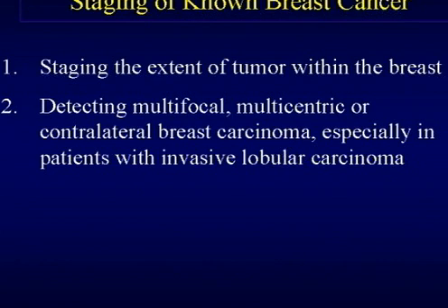So let's talk about staging of known breast cancer. You really are trying to see how much cancer is in there. So you may be seeing multifocal, which is disease defined as within one quadrant of the breast, or multicentric, which is disease in multiple quadrants of the same breast, or contralateral disease, which is especially common in patients with invasive lobular carcinoma.